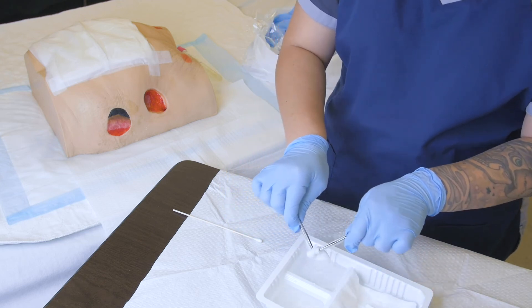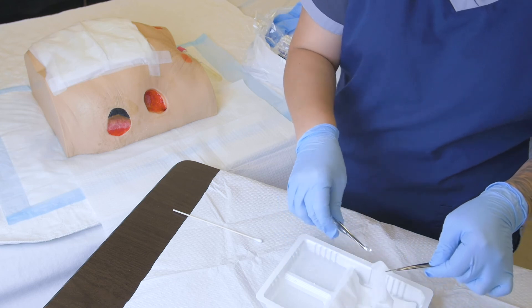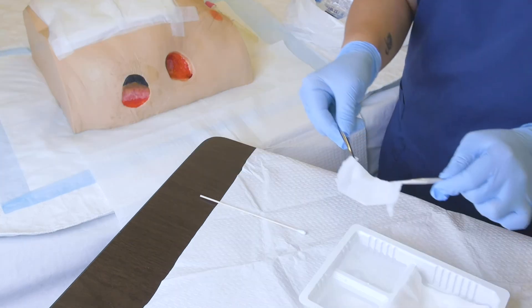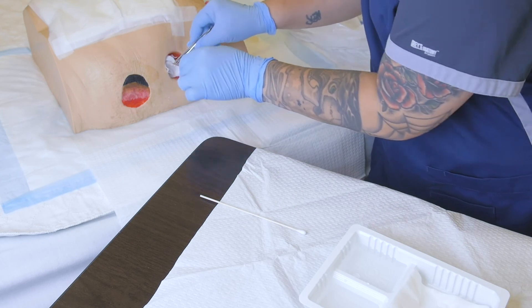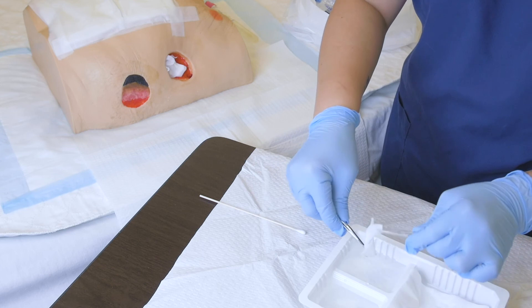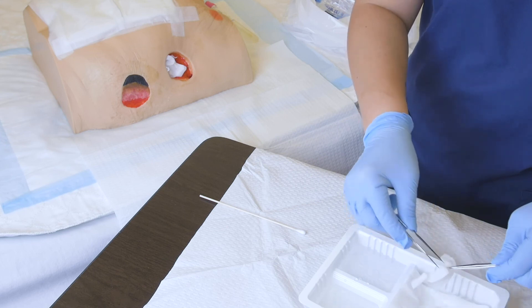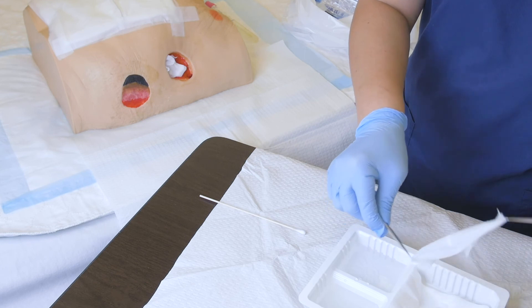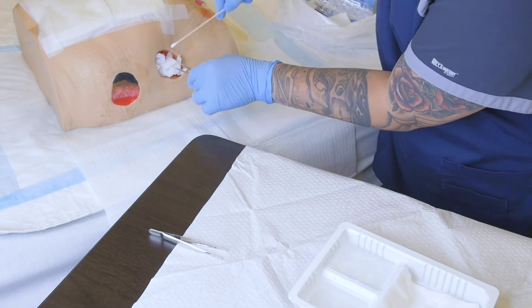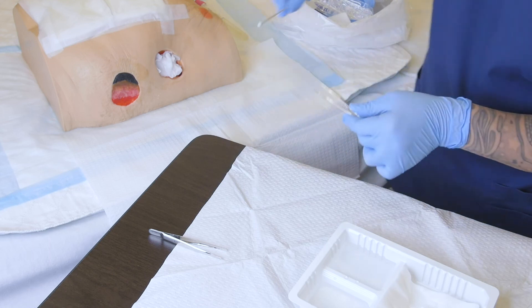Now we can pack the wound bed. We're using moist-to-dry packing as per the order, so we take a small piece of two-by-two gauze, wet it with saline, wring it out, and unravel or open it so it's fluffy once inside the wound — not heavy on the wound bed. Because we removed two pieces, we generally replicate how much was used unless the wound has changed, in which case you may need more or less. We lightly pack the wound and use the sterile cotton tip applicator to help guide the packing and avoid trauma to the wound bed.